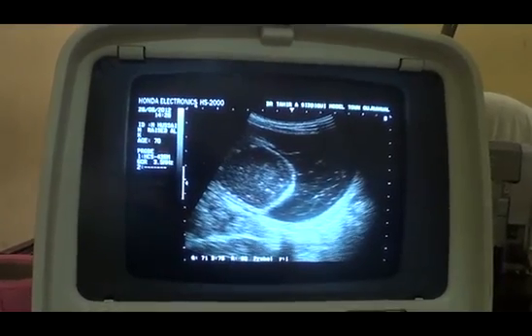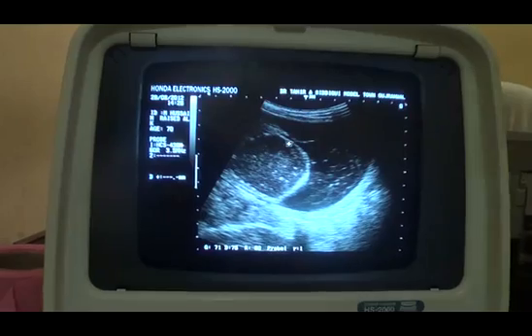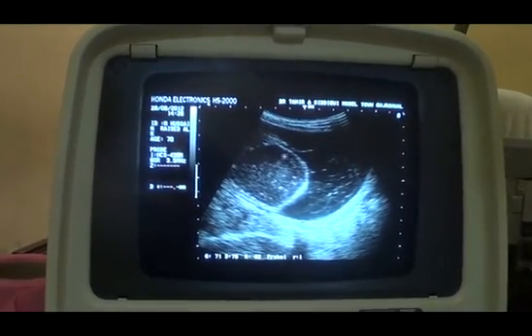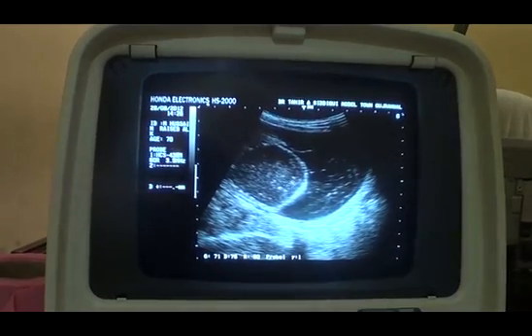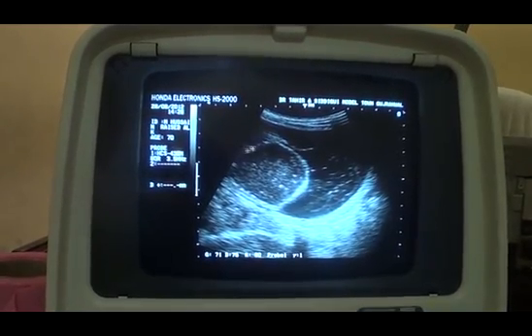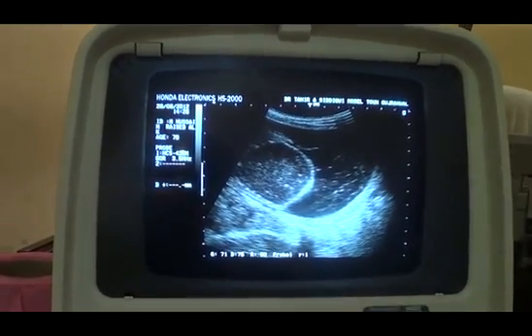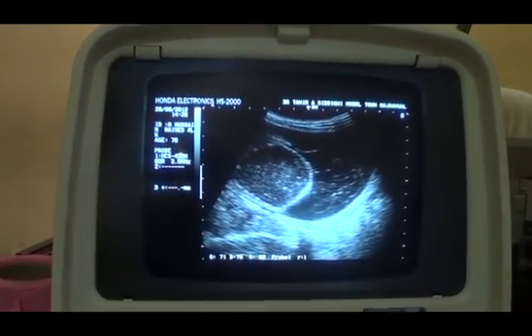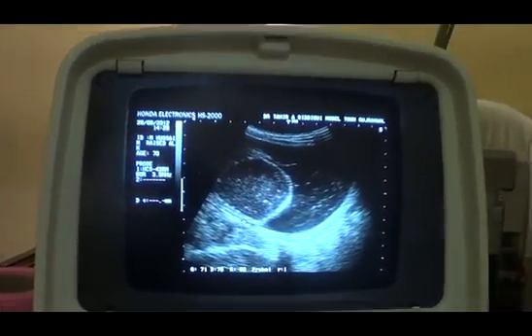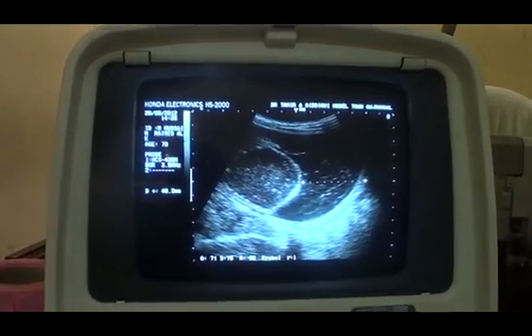So you see that this is the gallbladder. Anterior portion is rather a bit clear. The dependent region is full of different strength internal echoes. This is the wall. This is the loculated fluid pocket. This is the wall, and these are the septa within the cystic area, the loculated cystic area that is extending into the lesser sac.